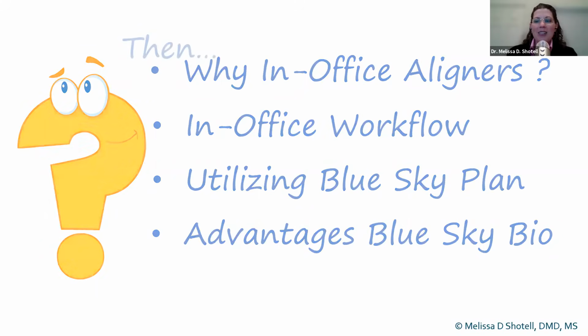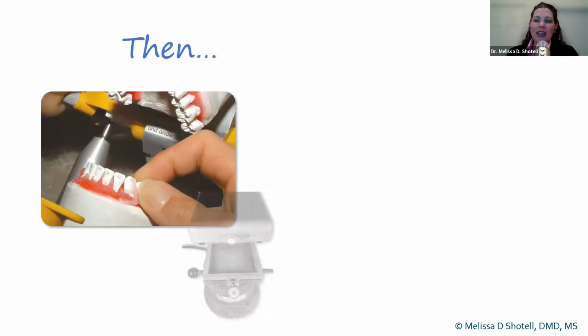So looking back historically, clear aligners actually began as an in-office process. I know most of us that are in practice now are used to seeing major aligner laboratories that create the treatment setup and fabricate the aligners for us. However, this is really where clear aligners truly began, in office.